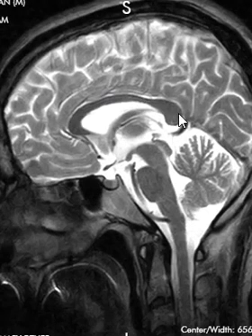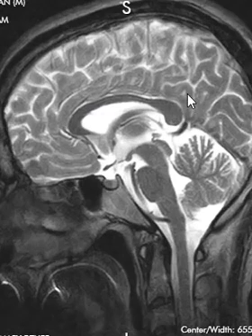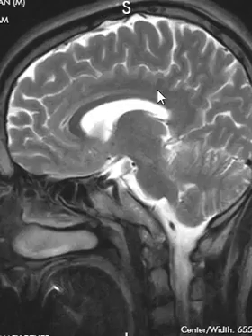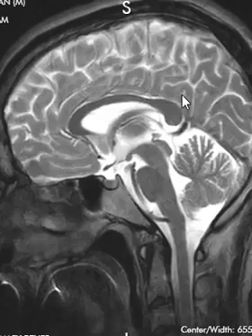We look carefully at the corpus callosum — sometimes there can be developmental abnormalities in it, or sometimes people with multiple sclerosis will have little lesions that go right up to the edge of it. So we look at that, and it looks good in this patient.